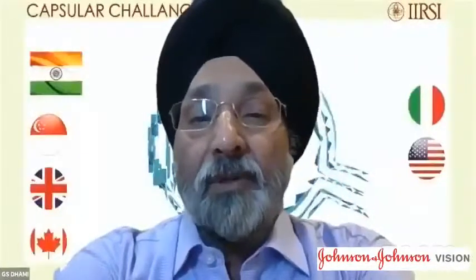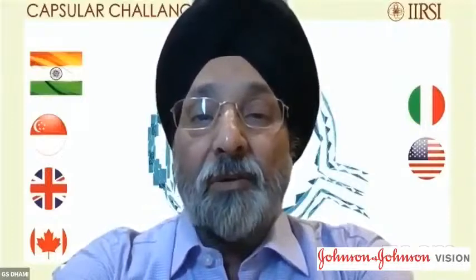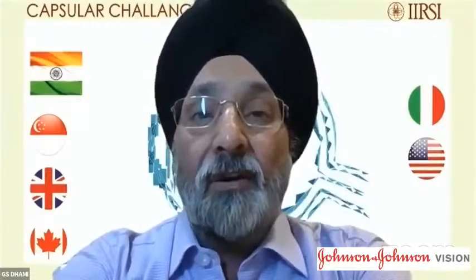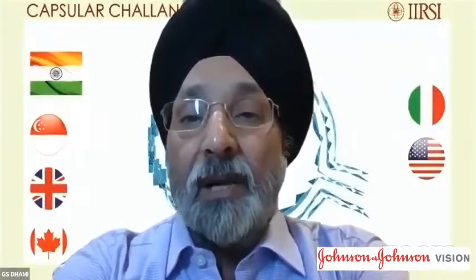Yeah, Rohit, very well demonstrated. As you see on the anterior segment OCT, you do get pockets, and you can really realize how many pockets of fluid are behind the nucleus. Like Dr. Rohit said, it's just rocking the nucleus to break those pockets, and immediately the fluid will gush out, and you have a completely flat capsule behind the nucleus. Great, thanks. So the OCT is quite an innovative thing on the femtosecond platform, as well as standalone. Before you do the surgery, you can do the OCT to check these pockets, as Dr. Dhami has described.